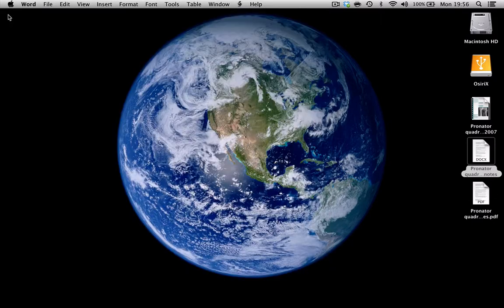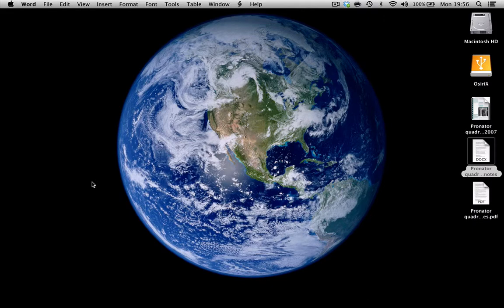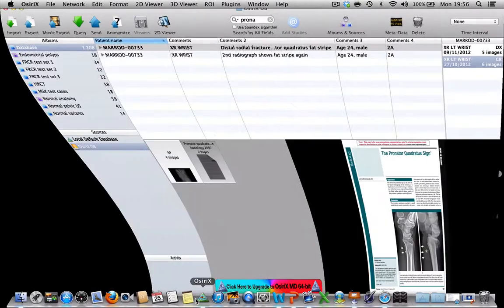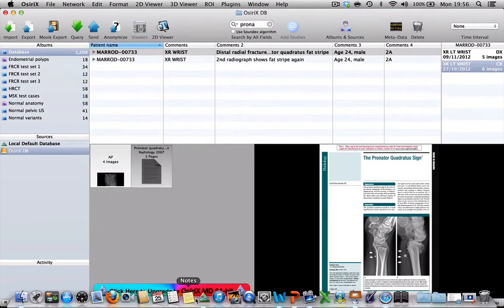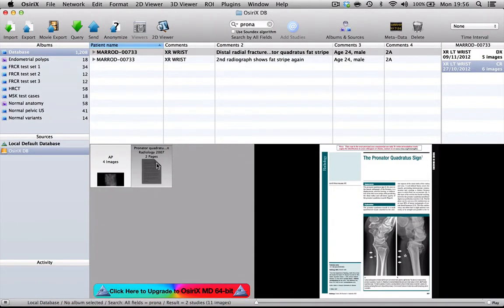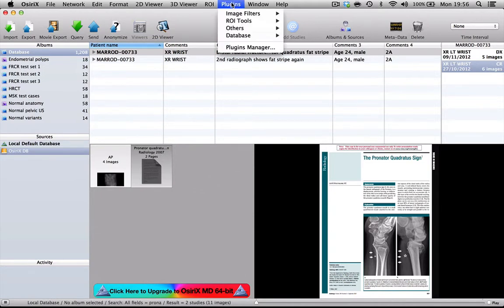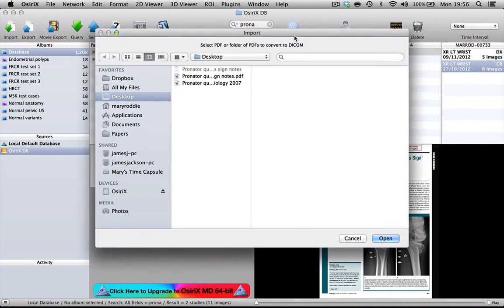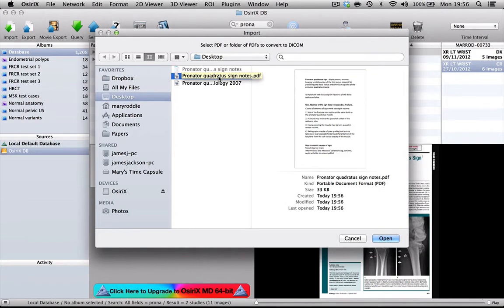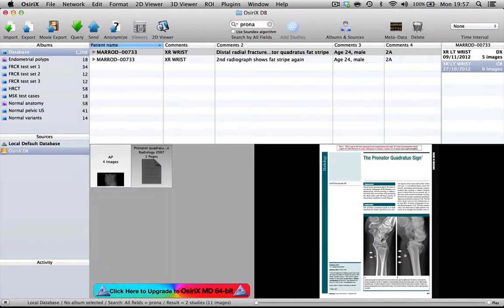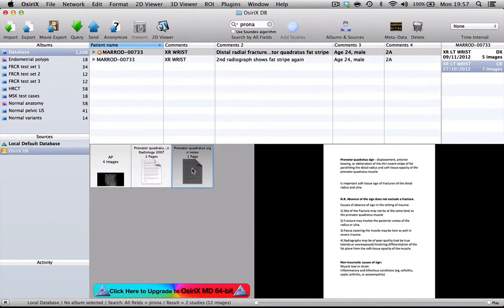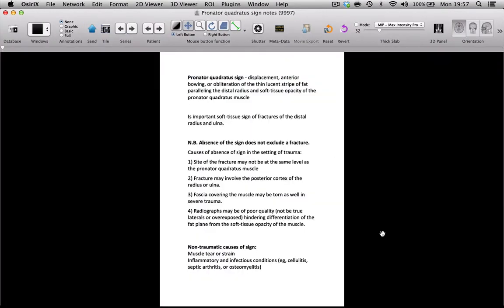So I'm now going to be able, in exactly the same way as I just showed you, to import that document as well into OsiriX. So again, I go to Plugins, Database, PDF to DICOM and there's my PDF of the notes that I made and I simply press Open and you can see that that has appeared as a separate file.